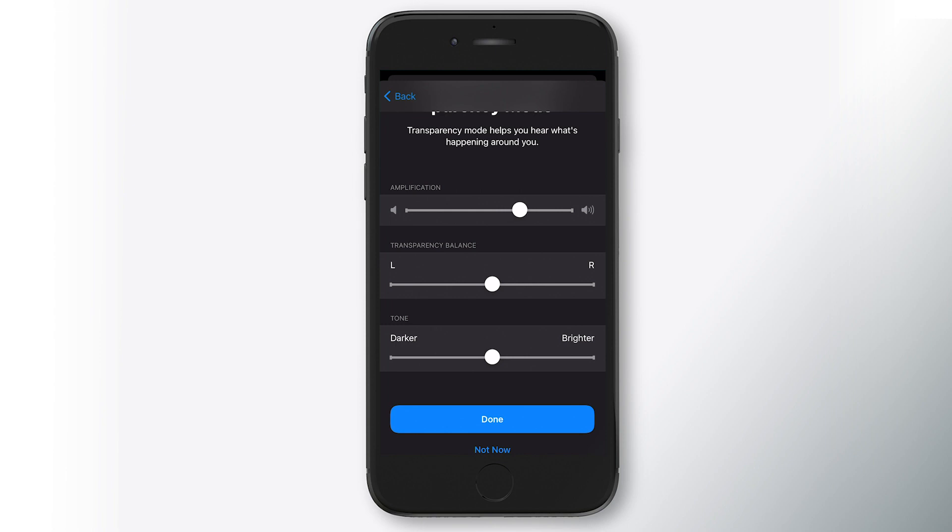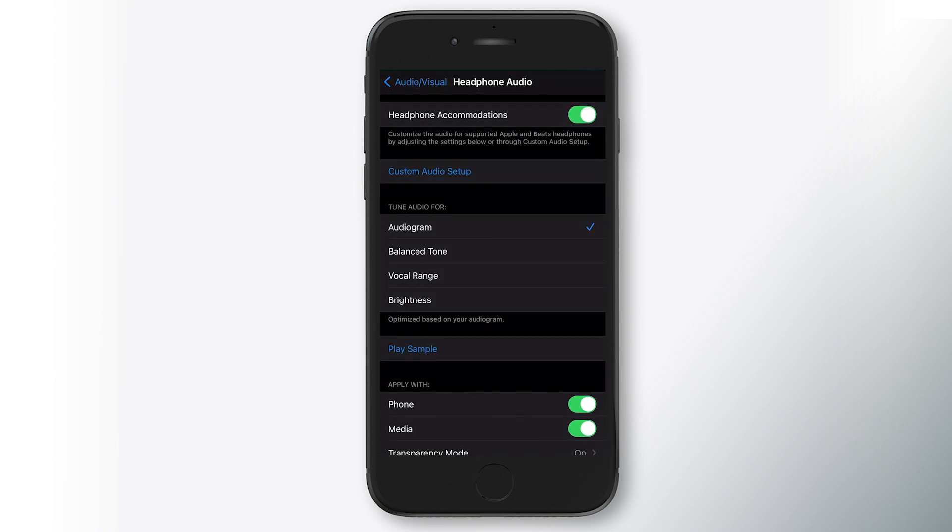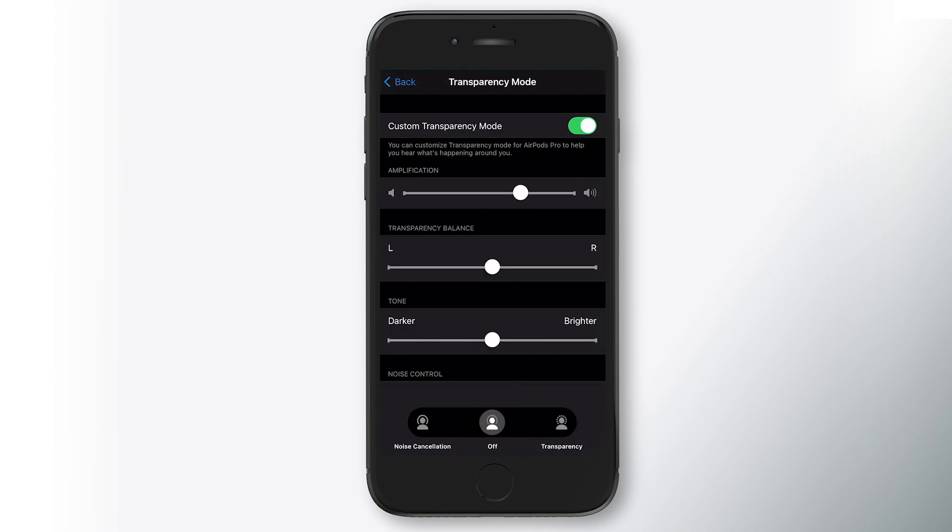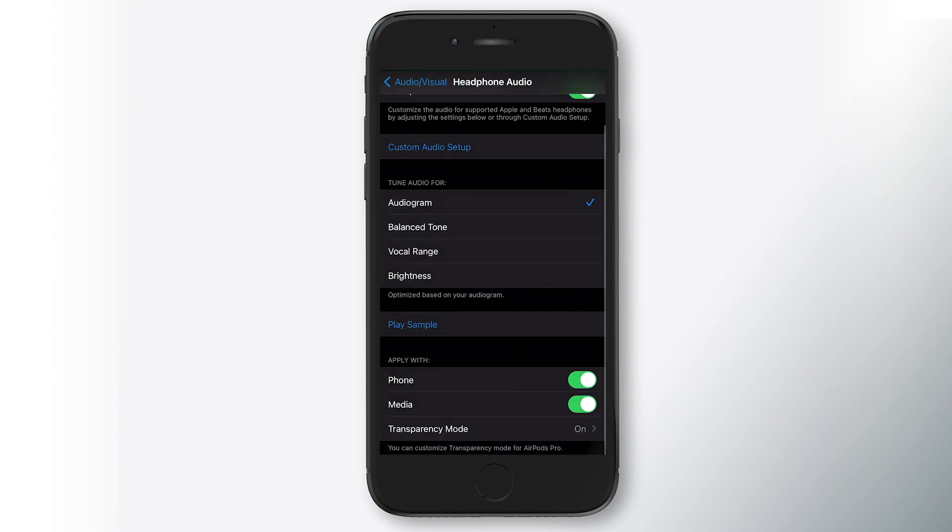So I'm going to click done. You'll see down at the bottom, now we have transparency mode. So apply with phone media transparency mode. What that means is phone and media, so your phone calls coming through the AirPods and media coming through the AirPods will be adjusted to your audiogram. So music will sound great. Phone calls will sound fantastic. And if you click on transparency mode, it brings back amplification settings. So that is the audiogram settings.